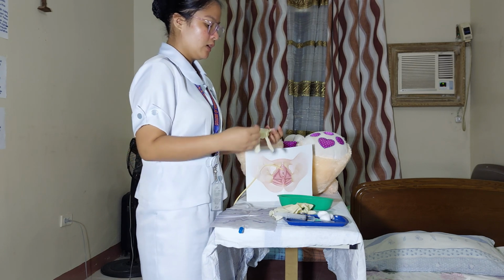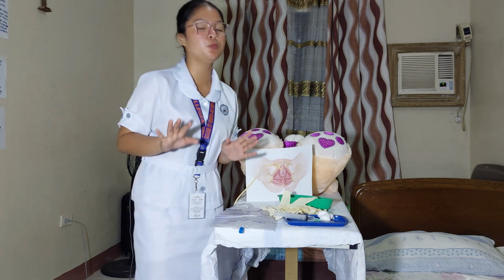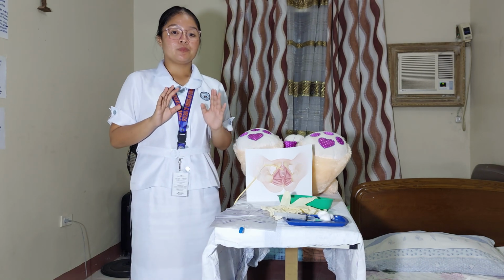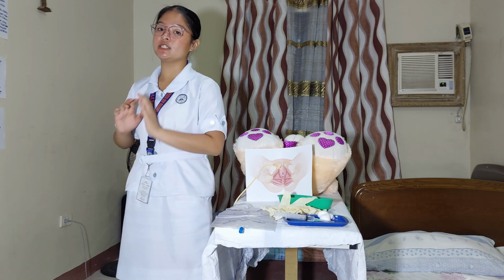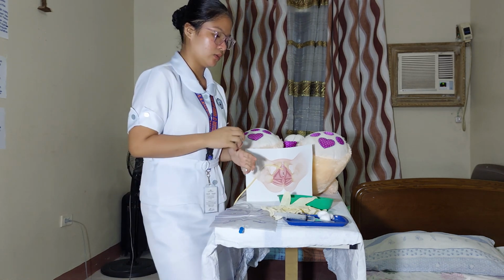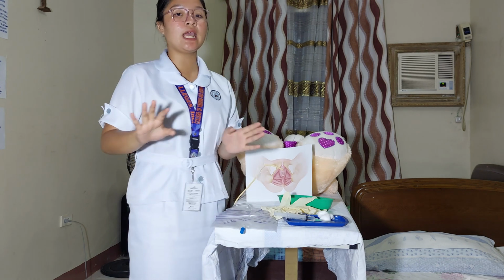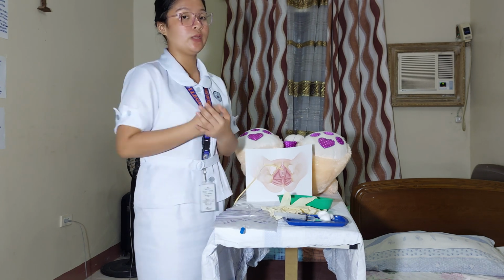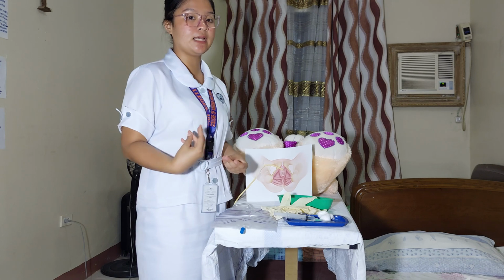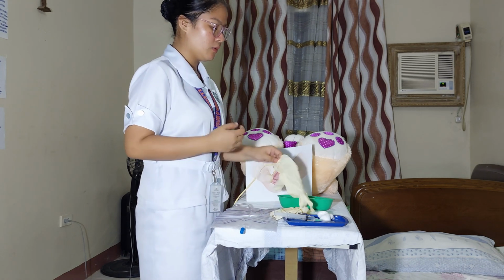So now I'm going to wear my gloves. Or before I wear my gloves, I'm going to practice proper hand hygiene, which is I'm going to wash my hands, and if ever, I'm going to disinfect my hands. So after I wash my hands, I'm going to disinfect my hands with alcohol. Then now I'm going to wear my gloves.